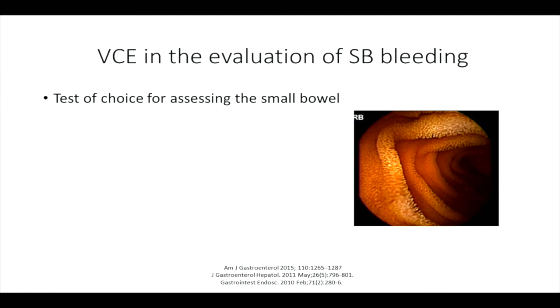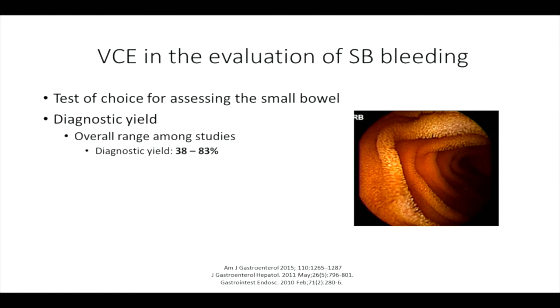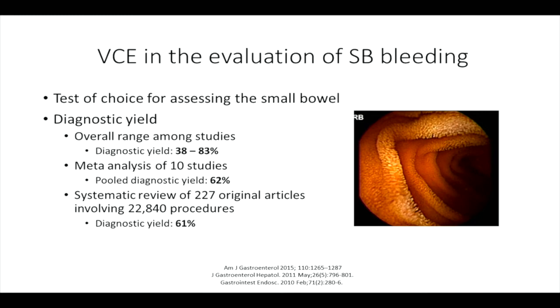It is non-invasive. It is effective in visualizing the entire small bowel in approximately 80% of cases. And the diagnostic yield is actually fairly good. The overall range among numerous studies of capsule ranges from around 40% to over 80%. And a number of meta-analyses and systematic reviews have also been done. And the diagnostic yield is probably somewhere around 2/3, which is what I tell most patients, that with this test, we have about a 2 out of 3 chance of diagnosing what the problem is in your small bowel.